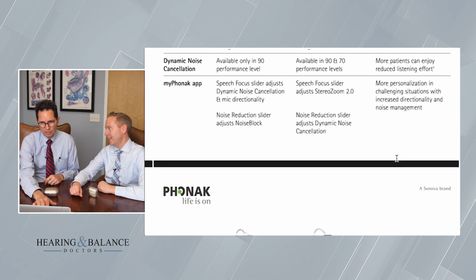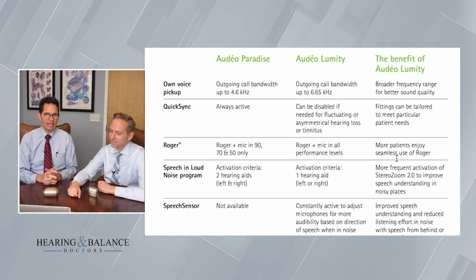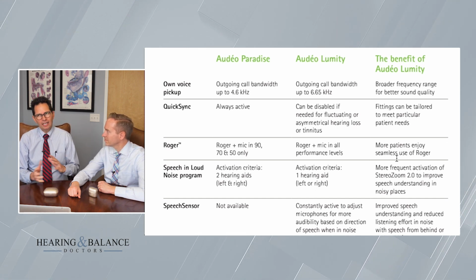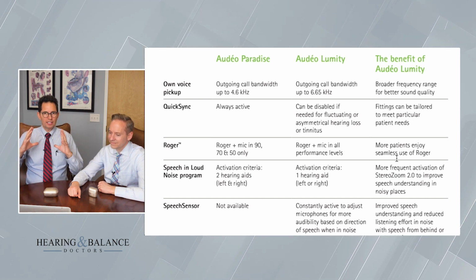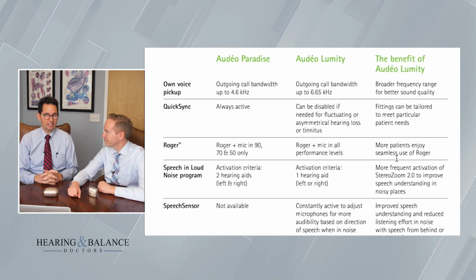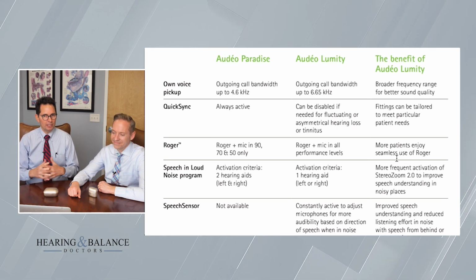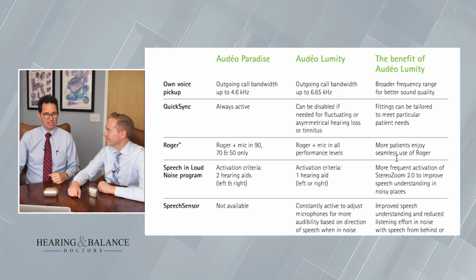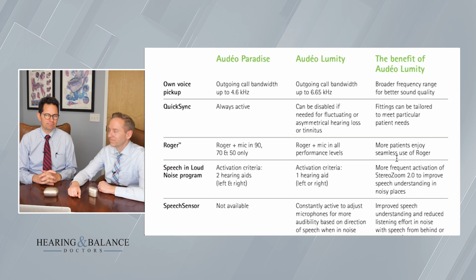Well, tell me about the app. The app has some features. So there's some sliders where you can slide how much noise you're willing to let in and how much noise you don't want to come in. You would think you don't want any noise, but the truth is, with compression, meaning the circuit is trying to compress down the noise, if you add too much compression in any of these hearing devices, it does kind of squelch or reduce or dampen the normal characteristics of the speech you're trying to acquire. So if you're really trying to go for as much speech as possible, you don't want to just slam the no noise, because the speech will become a little muffled, not quite as clear and sharp.